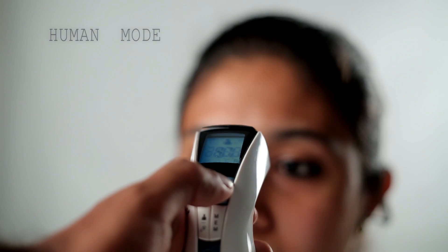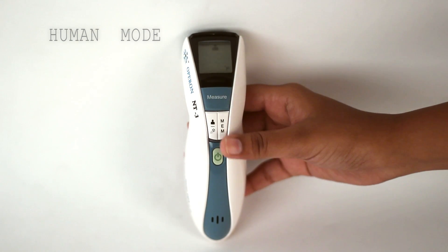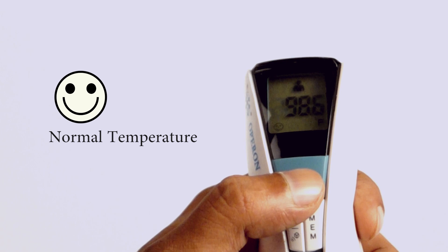Select human body, press and hold measure button and bring close to forehead and keep distance. You will hear a continuous beep sound, that is where you release the measure button. The results are displayed.